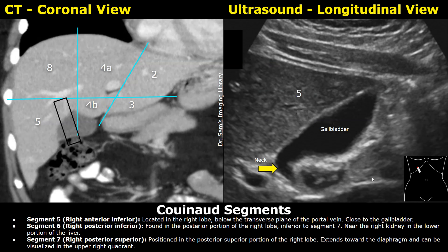When you locate the gallbladder in longitudinal view and get this type of image, just remember the segment that is anterior to the gallbladder will be segment 5. This is the gallbladder in the CT image in coronal plane. You can see segment 5 next to the gallbladder — segment 5 is the anterior inferior part of the right lobe.